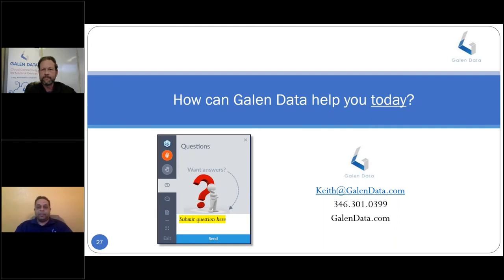Yes, sure. SOUP is a definition in IEC 62304, which is a standard for software development processes in medical devices. What it means is essentially software that you do not know how it was written, whether it was written in compliance, whether there were quality processes around when that software was developed. So essentially any software where you cannot vouch for its practices, its stability, its reliability is considered a SOUP. Most of the open source software will fit into that, but also even commercial off-the-shelf software, if you don't have insight into how it was built, is considered a SOUP as well.